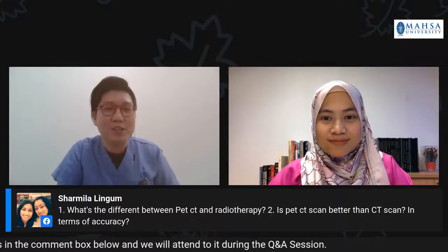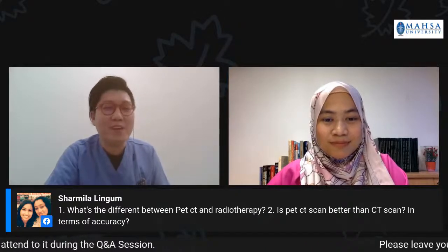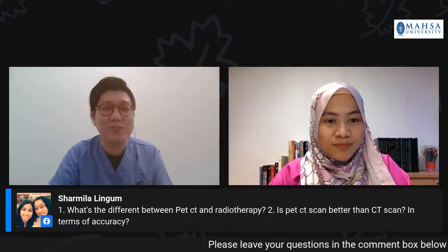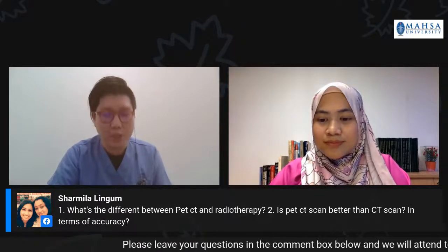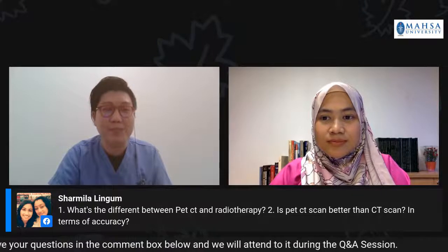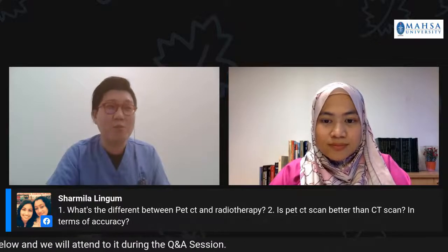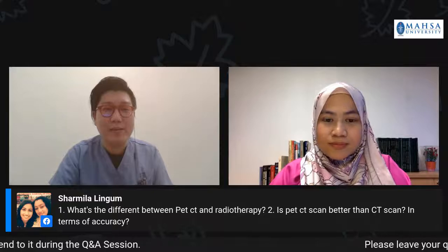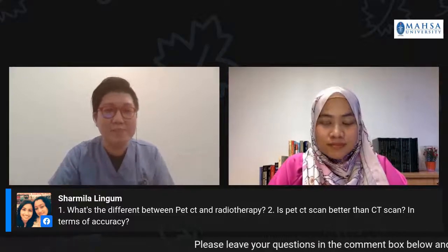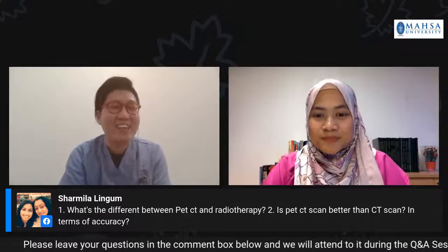All right. Thank you, Ms. Sharmila. Okay, let's look at question one here. What's the difference between PET-CT and radiotherapy? PET-CT scan, we use it for diagnostic, and radiotherapy, they will use it for treatment, for therapy purpose. So yes, no doubt we work side by side, we work together, but the difference here is one is for diagnostic, another one is for therapy. Is PET-CT scan better than CT scan?